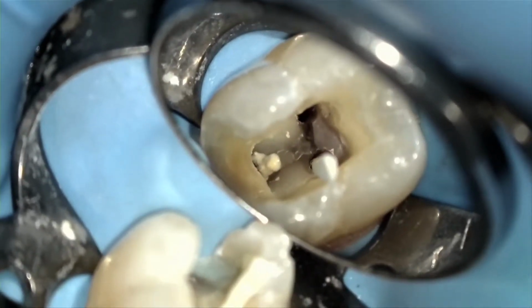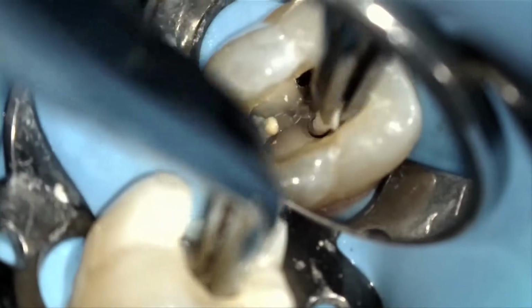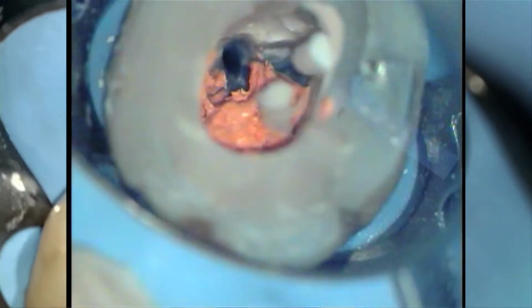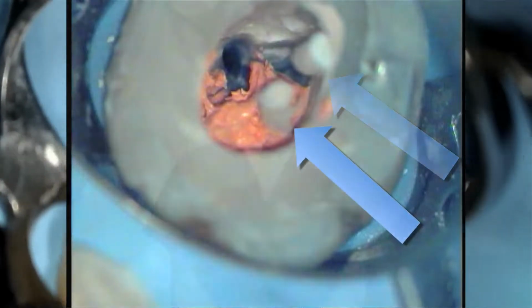Next, in teeth with multiple canals, I like to block the orifices of adjacent canals by using paper points that are larger than the size of the master files. The larger paper point does not need to reach the canal lengths. It only serves to prevent overflowing warm gutta percha from blocking out adjacent canals.